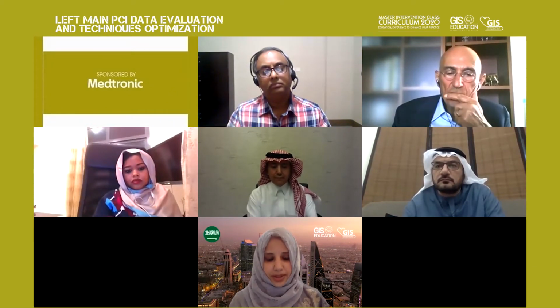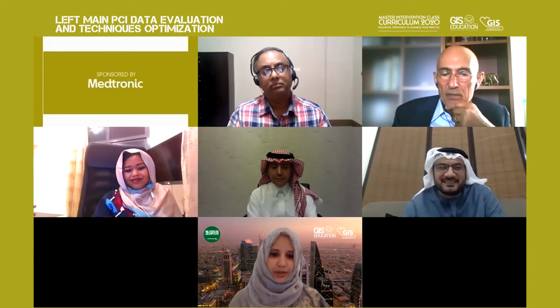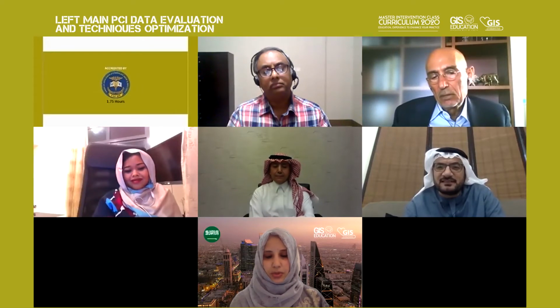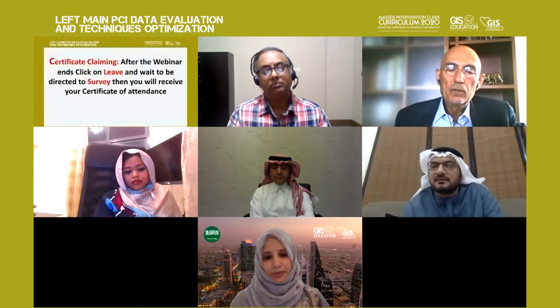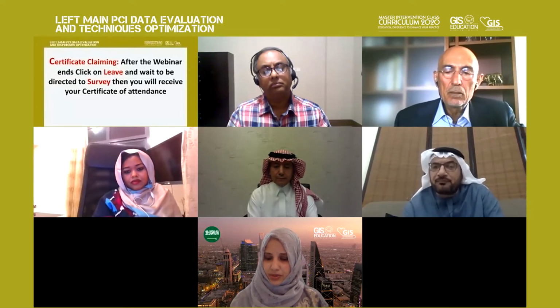And my final point, and this is once again not for expert operators, it's just to kind of break it down for fellows in training, is when we are trying to recross into a side branch, we try to go distally into the main vessel and then kind of pull back and recross so that we know that we are within the lumen. Of course, we try to use intravascular guidance, ultrasound for guidance as best as possible for our final result.